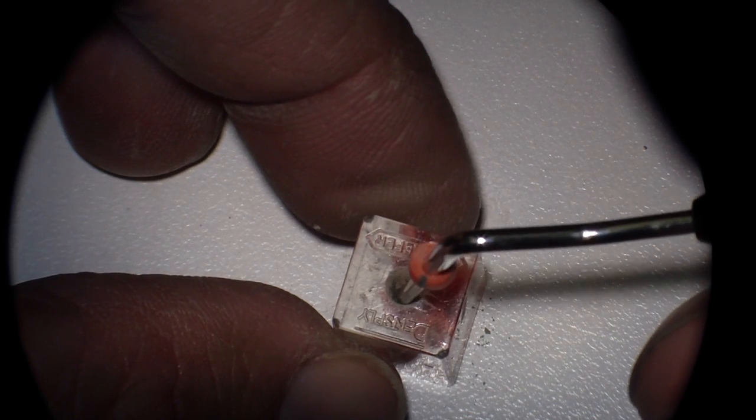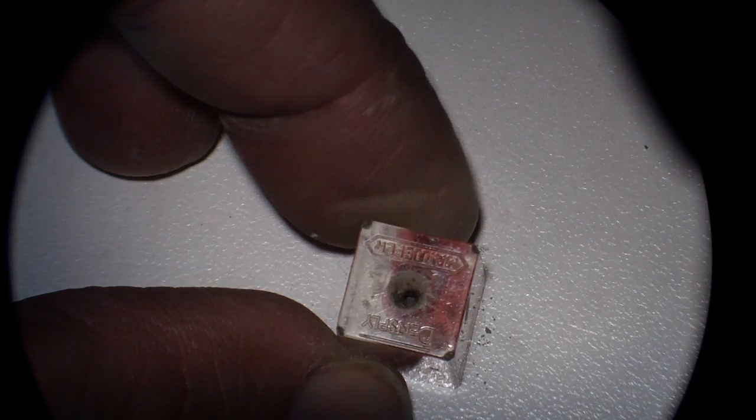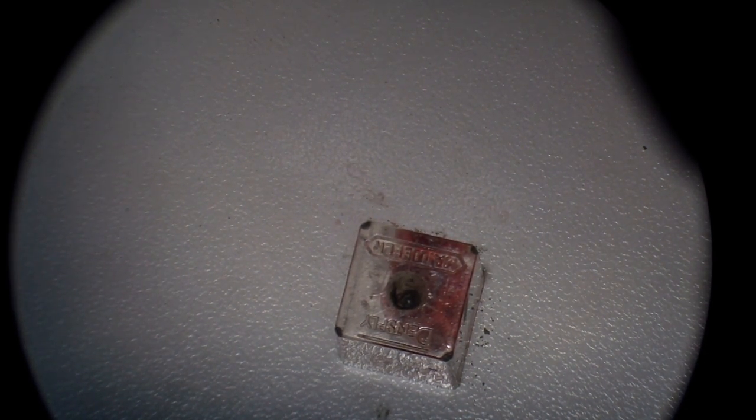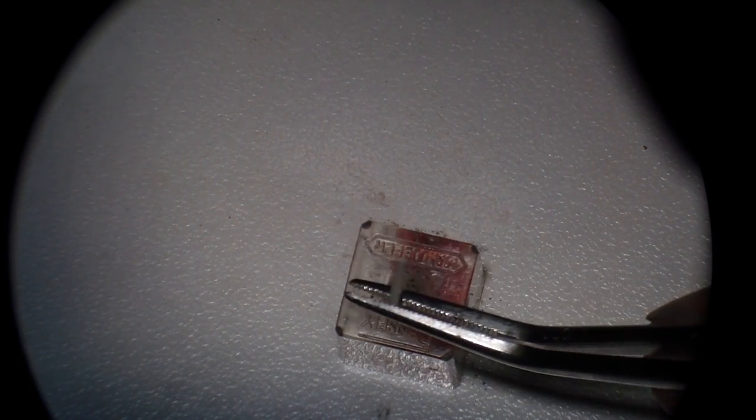In an effort to condense it against the walls. If this does become too, if you find that it's too wet, say for this example, after you do that, let me just add some fluid here. What you can do is take, you've got a paper point, and just use that to dry.